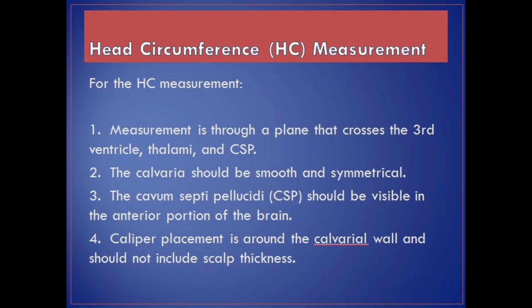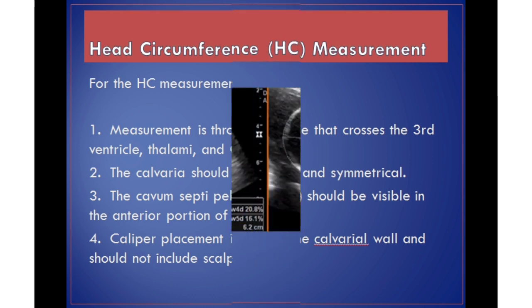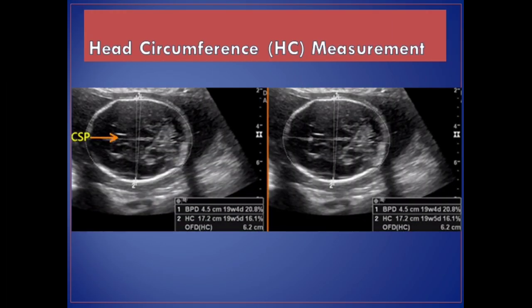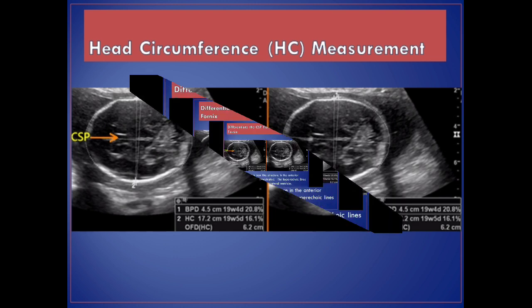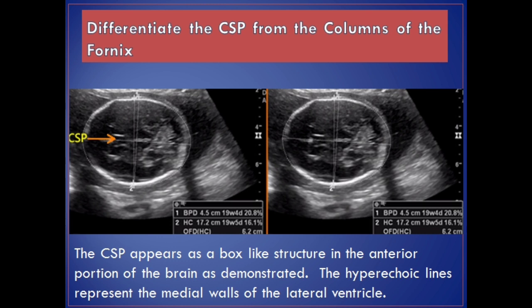Head circumference, HC, measurement. Measurement is through a plane that crosses the third ventricle, thalami, and CSP. The calvaria should be smooth and symmetrical. The cavum septi pellucidi, CSP, should be visible in the anterior portion of the brain. Caliper placement is around the calvaria wall and should not include scalp thickness. Differentiate the cavum septi pellucidi, CSP, from the columns of the fornix.